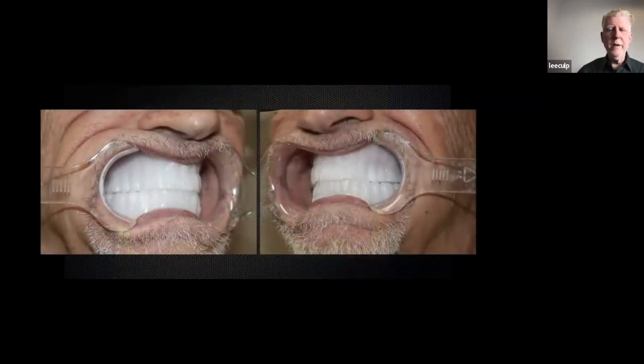Now, we did a lot of things with the digital denture system with Ivoclar. We did one time and never did it again. We didn't have a lot of printable materials back then, so this was their suggestion: they gave us just a white disc and you mill it out for try-on, which is okay. You can do fit, you can do occlusion.